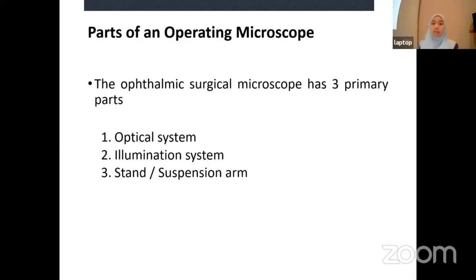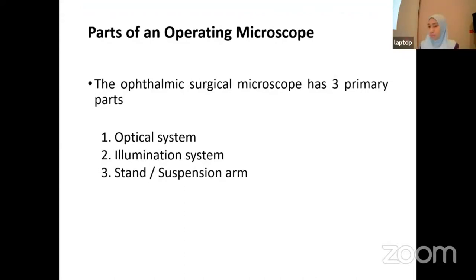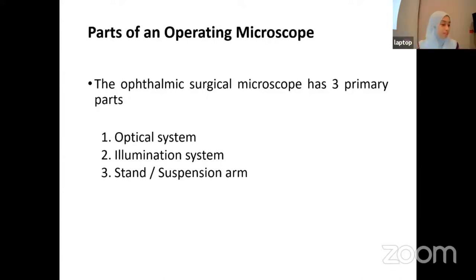The ophthalmic surgical microscope has three primary parts. First is the optical system. Number two is the illumination system. And the last one is the stand and suspension arm.